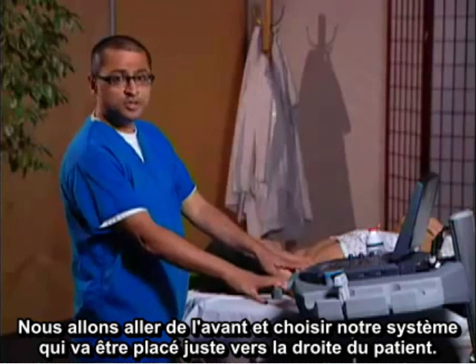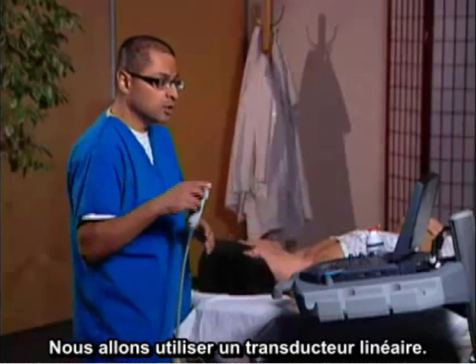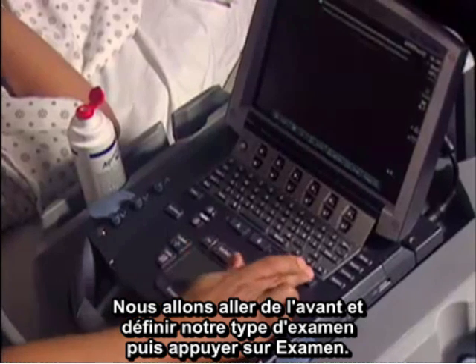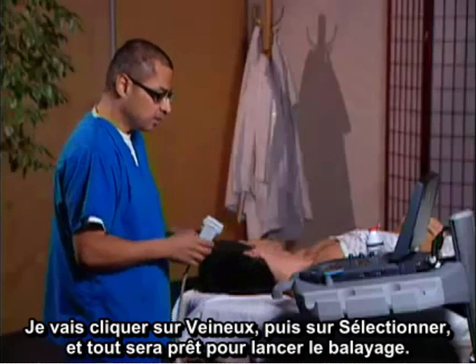We're going to go ahead and choose our system, which is going to be placed just to the right of the patient. We're going to use a linear array transducer. We're going to go ahead and set up our examination type. I'm going to hit exam. I'm going to click on venous, select, and we're going to be ready to start scanning.